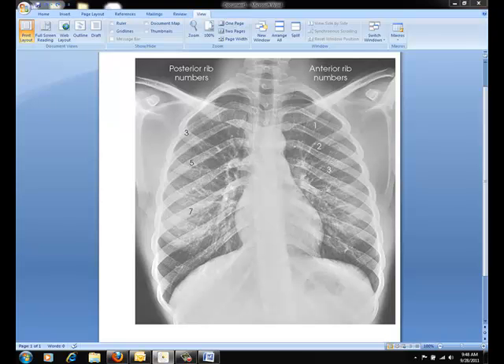One other thing to note before closing with the AP projection: rib fractures can typically cause a great deal of pain or hemorrhage because they're closely related to the neurovascular structures. Therefore, a deeper inspiration may be difficult for patients. Informing the patient of the importance of getting good deep inspirations and expirations will be really helpful in acquiring a very good image.